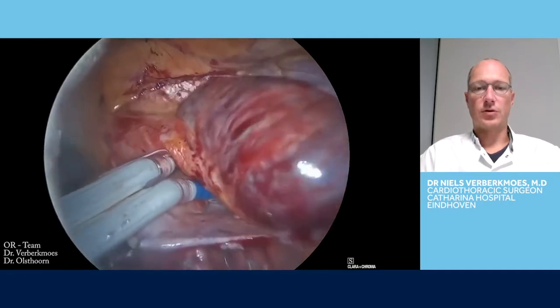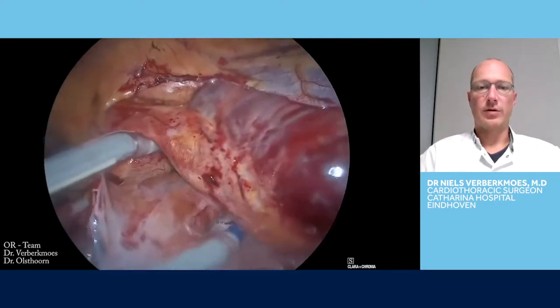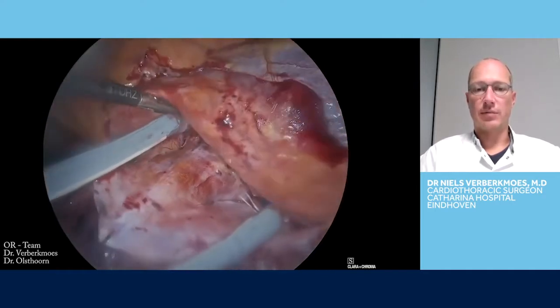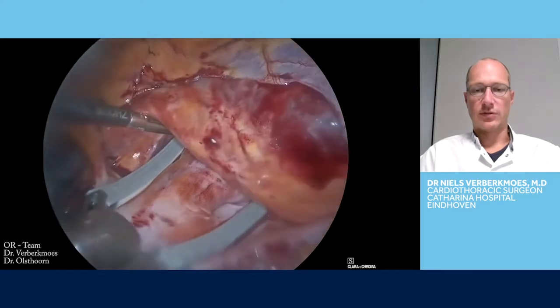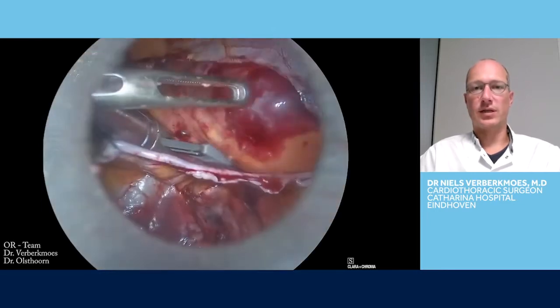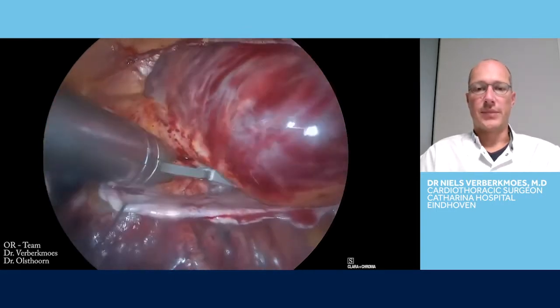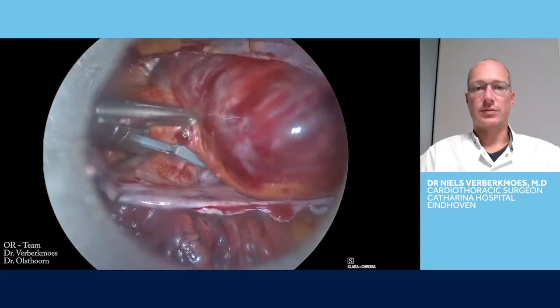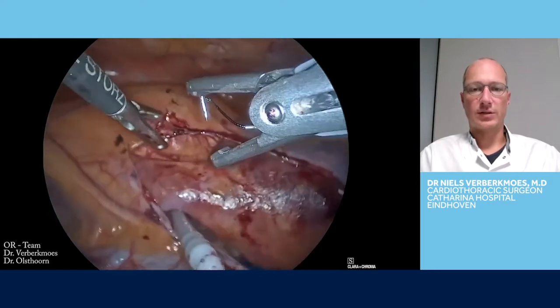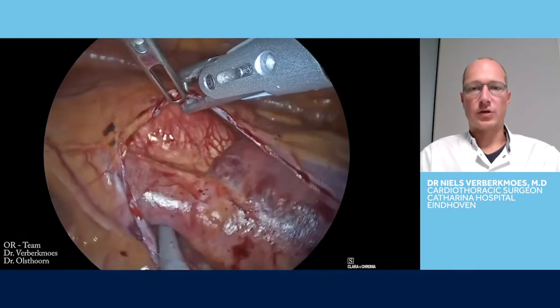So the clamp is turned around and then again is placed on the pulmonary veins, and half of the floor and half of the roof lesion will be finished by doing this introduction of the clamp. The convex and concave strategy is because we believe that crossing the lines from both sides will be better, and this will assure a complete box lesion. In very difficult cases, it could be an option just to do a convex ablation, but then you need to do 10 times a convex ablation on the right and 10 times a convex ablation on the left.